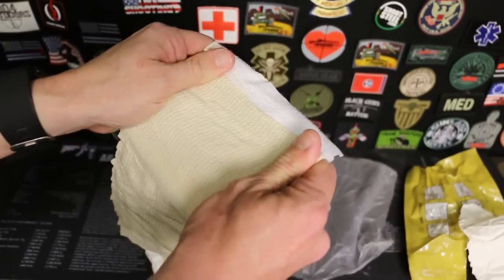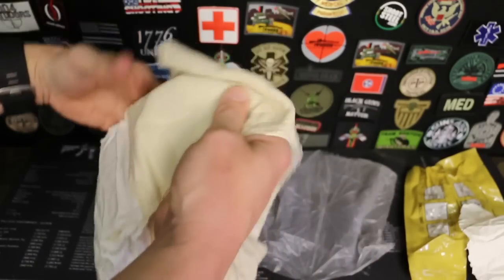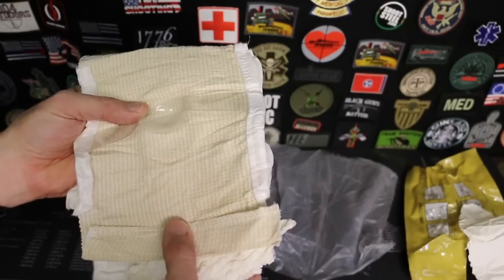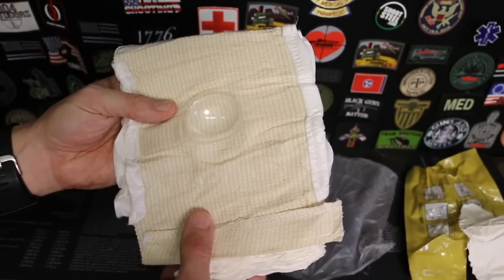It's this elastic, kind of stretchy material. This is where the wound goes. This is sterile when it comes out of the packaging, although you're really not overly concerned about sterility in a trauma situation. So let's get the mannequin out and show you what we'd use this for.